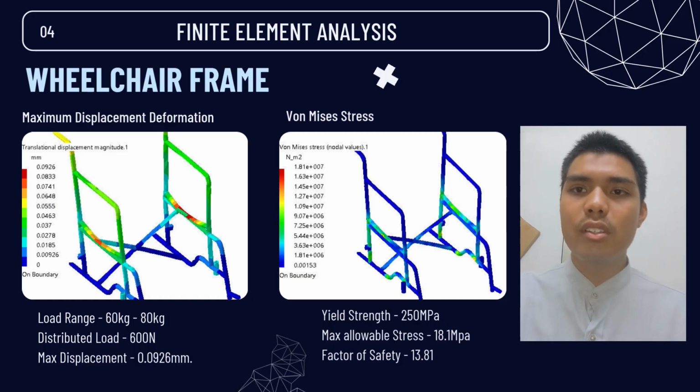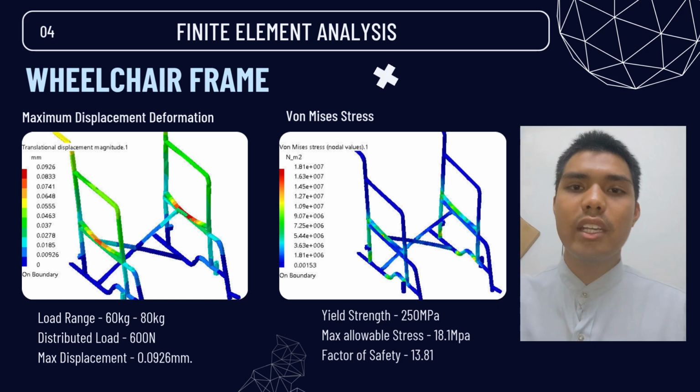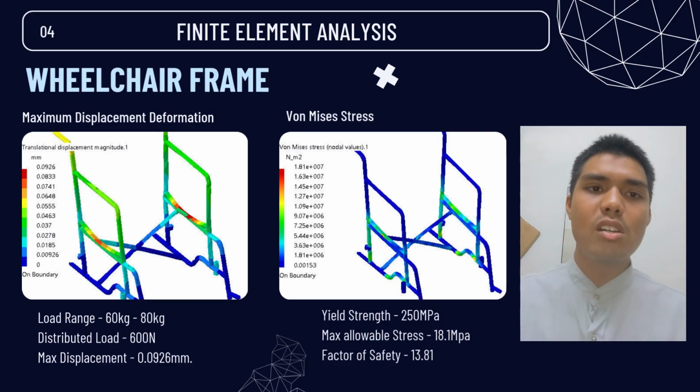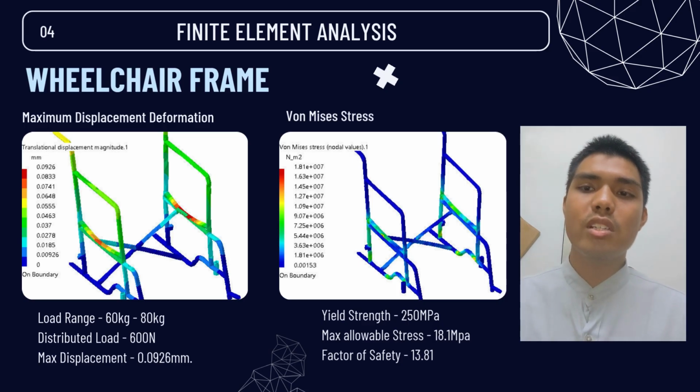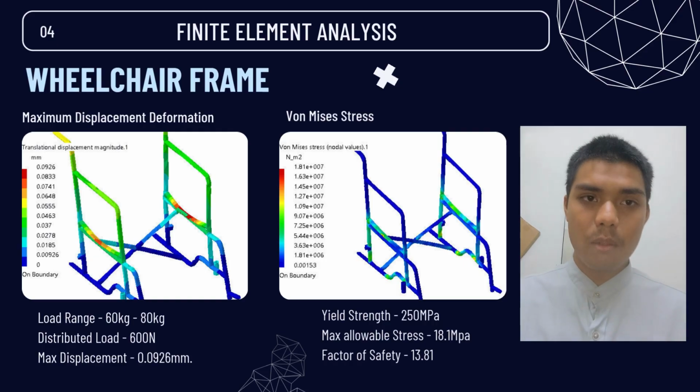Now we continue on the von Mises stress. We can see that the maximum allowable stress is 18.1 megapascal. From the general report from the CATIA, we get the yield strength, which is 250 megapascal. Therefore, we can calculate the factor of safety, which is yield strength divided by maximum allowable stress. So we can get the value, which is 13.81. The factor of safety on the steel frame bar is over 1, which means the design is acceptable. If the factor of safety is less than 1, it means there is some permanent deformation, which is not acceptable.